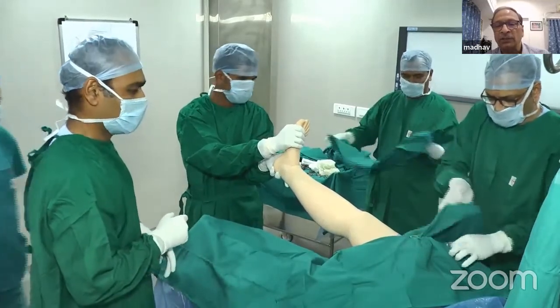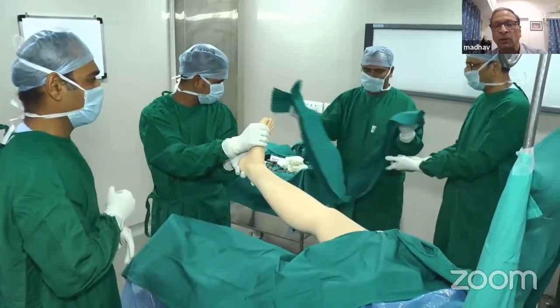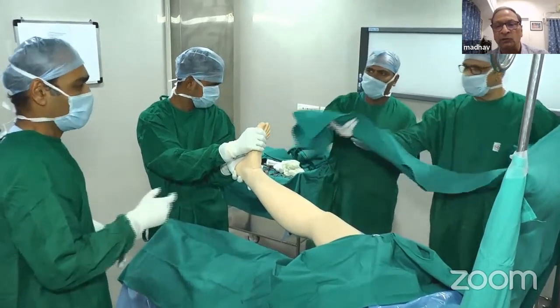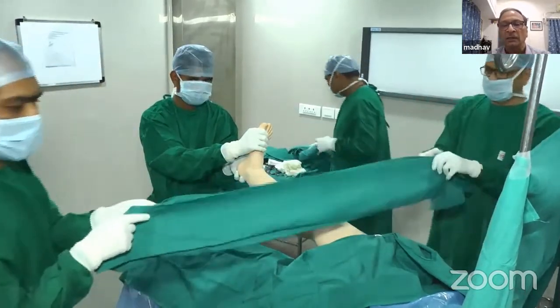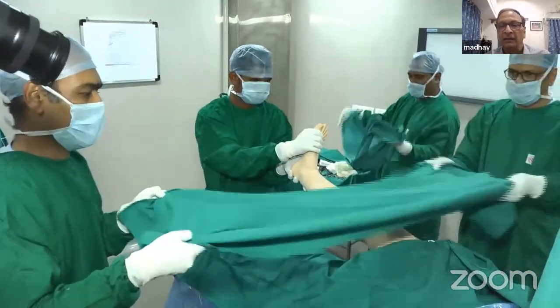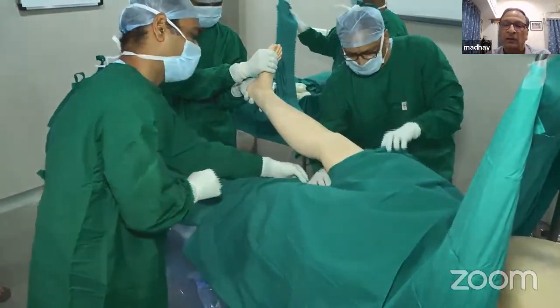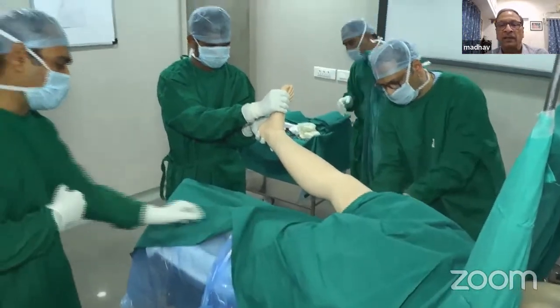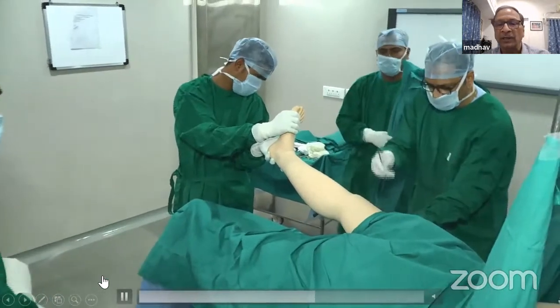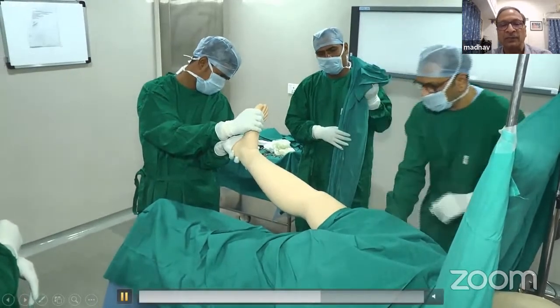Here take special precaution that you don't puncture or pinch the tourniquet, because if you are using a sharp towel clip, there is a danger of puncturing the tourniquet. So be careful where you are applying the towel clip. Now take a second big sheet and put it on the thigh and the upper body. Take the 2 ends around the thigh and secure it with a towel clip again, either on the posterior aspect of the thigh or on the lateral aspect of the thigh.